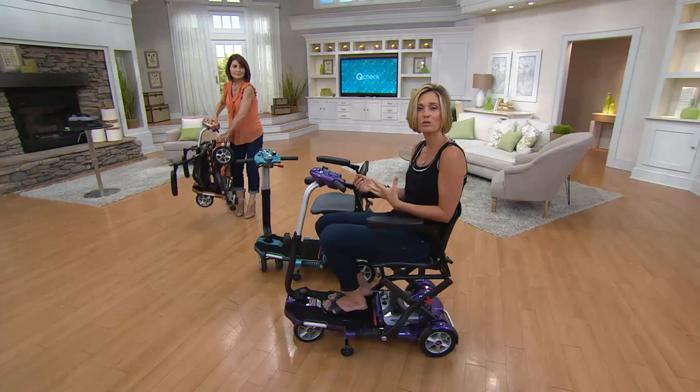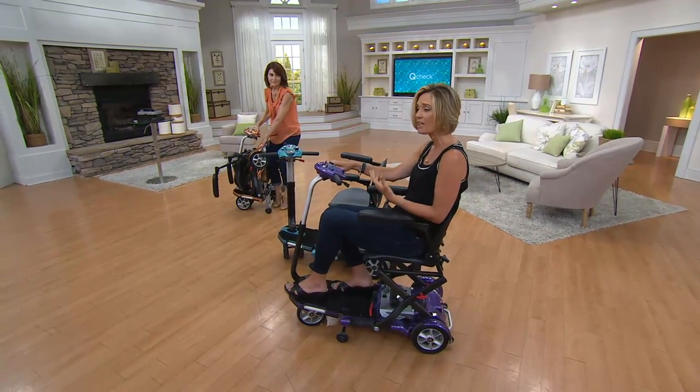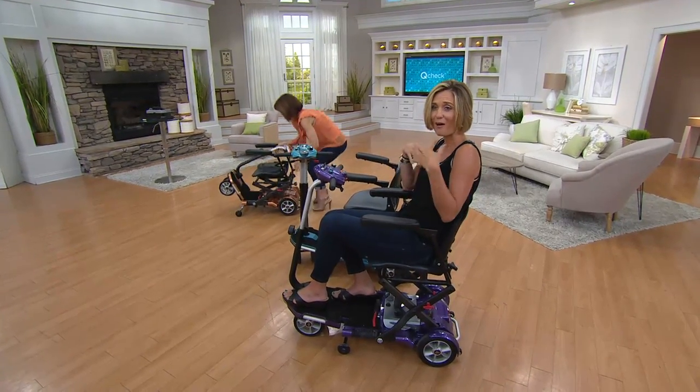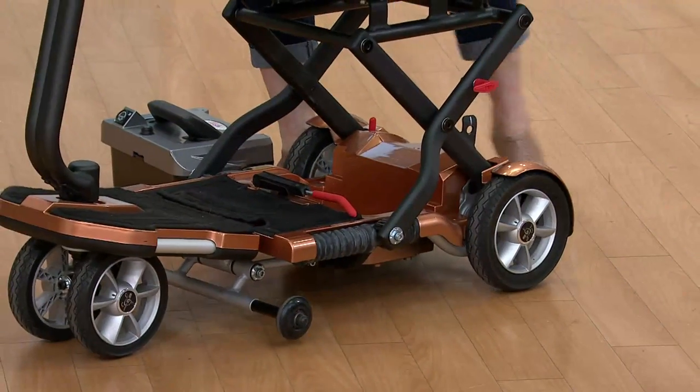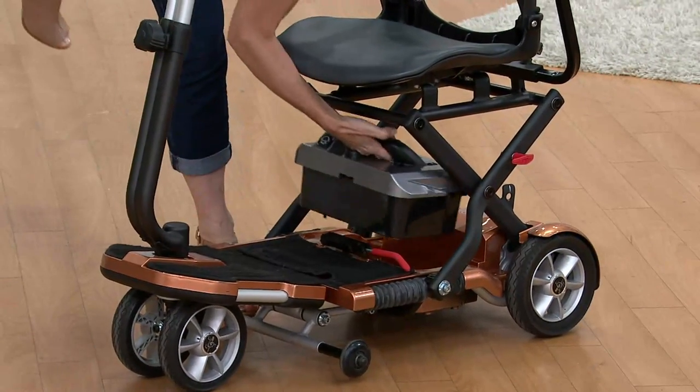This is a solution for people who are in those situations, because you can get out and chase around the toddlers on the scooter. Be able to go out to the playground and watch them, because you have your own seat and something that can get you around. Go shopping.